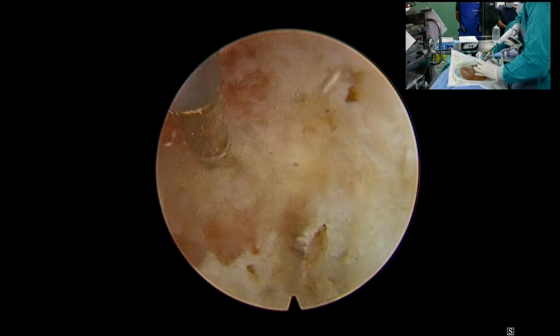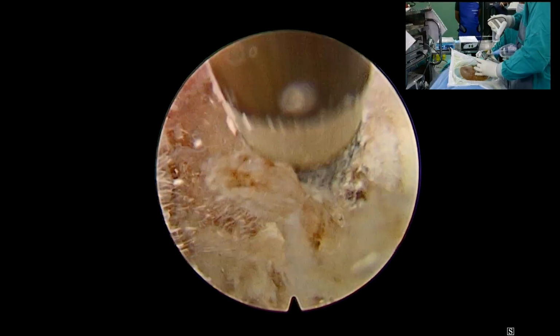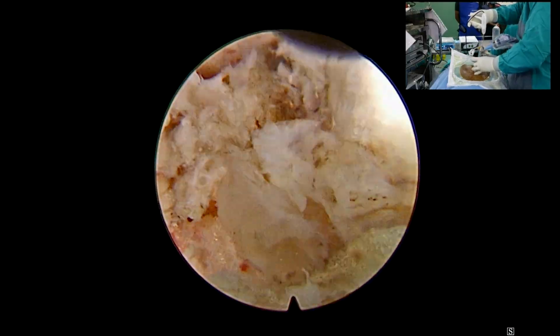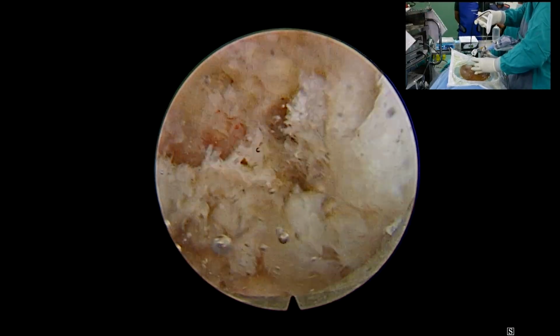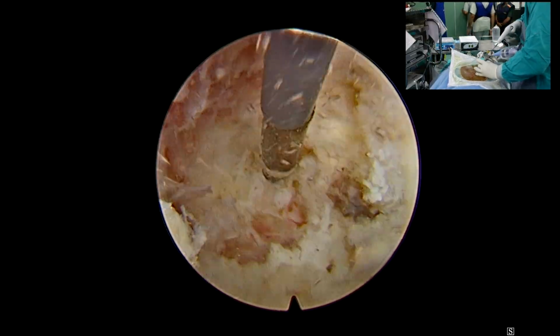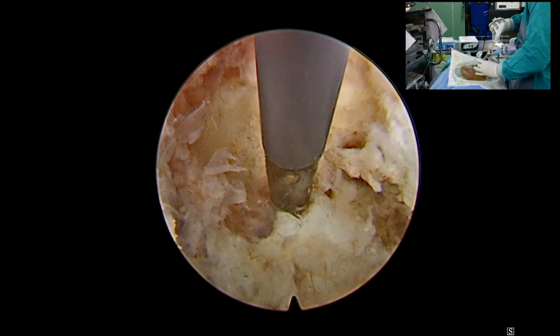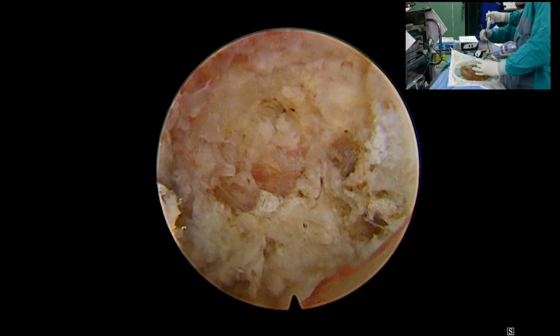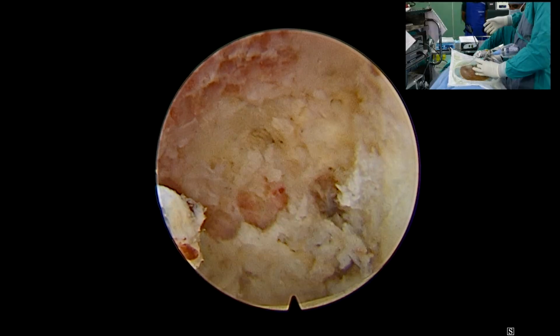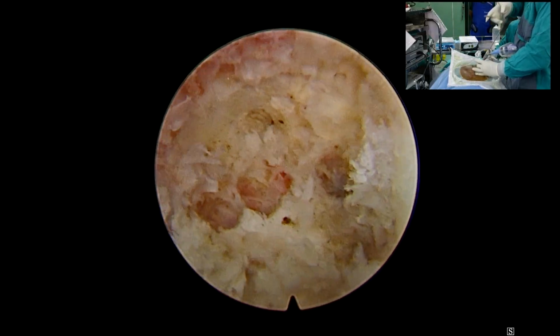So he is just trying to clear the spinous process and lamina, the spinolaminar junction. He made the window in the upper lamina. Now he will clear more on the medial side. The last place that he has placed it is the IAP area.